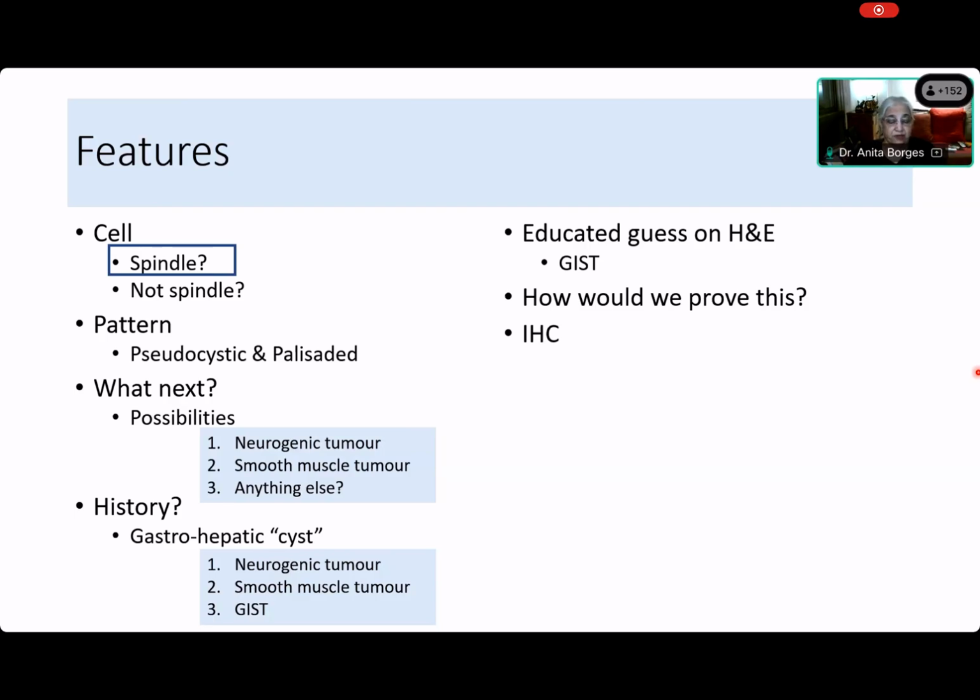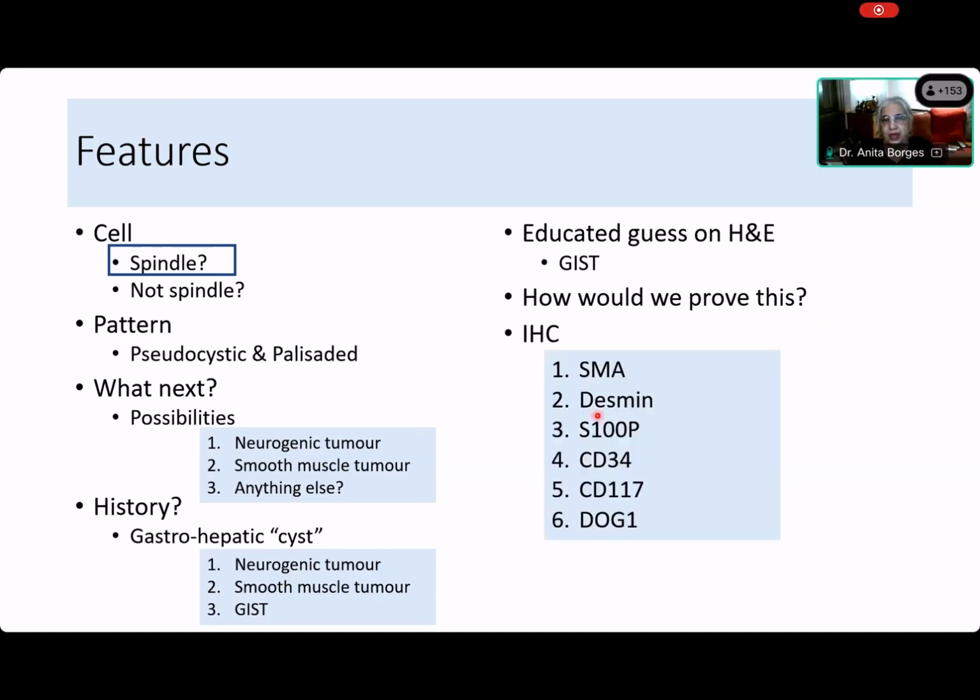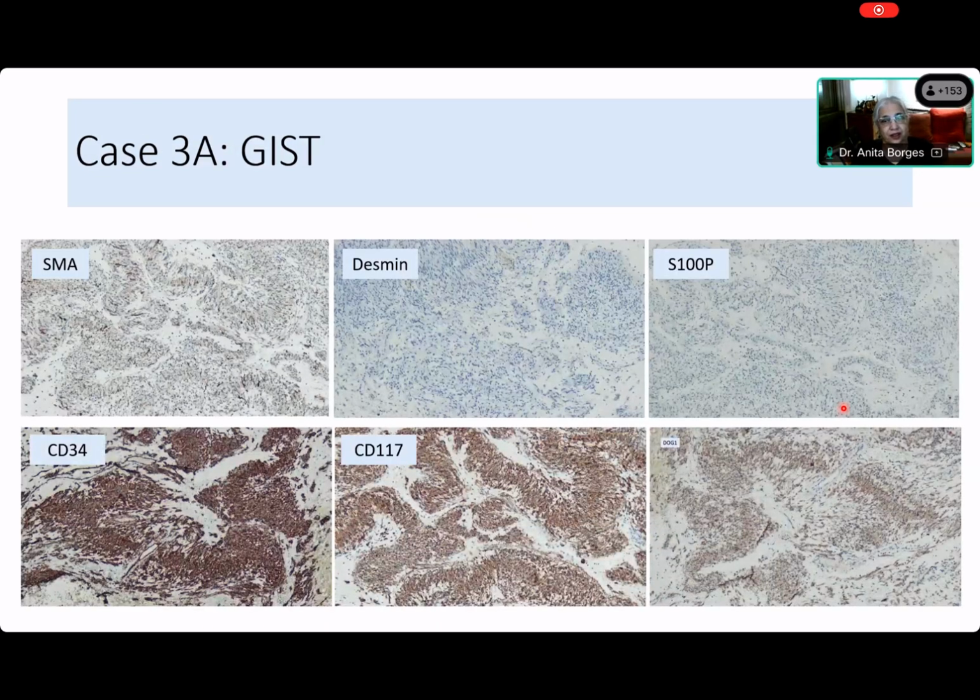What did I tell you when you are investigating any mesenchymal tumor? What should you do? You should do SMA, right? So SMA, S100, and because you thought of gastrointestinal stromal tumor, you should add CD117 and DOG1. We've got so much echo today. So here is your gastrointestinal stromal tumor.